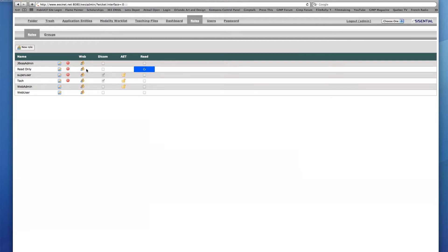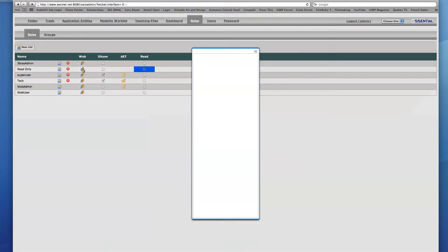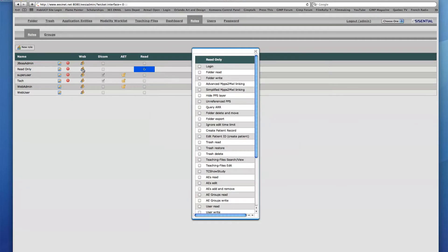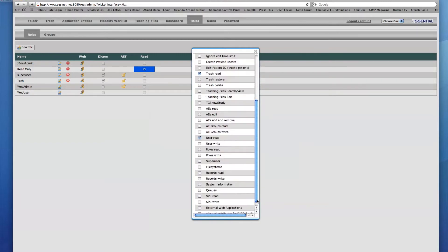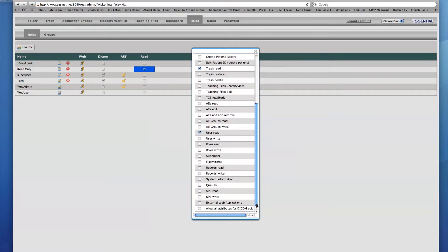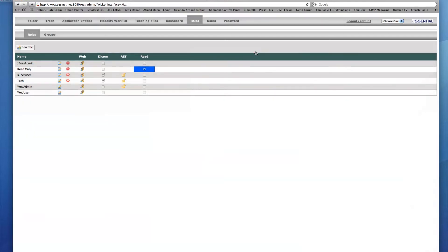Next, I'll click the Web permissions icon and enable Folder Read, Trash Read, User Read, and Roles Read. When I click the X, the role will automatically be updated.